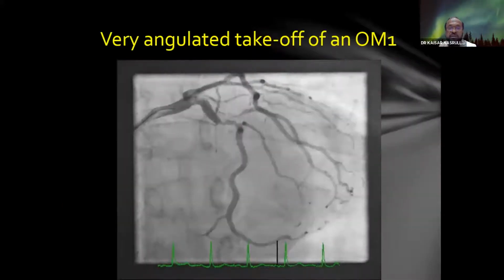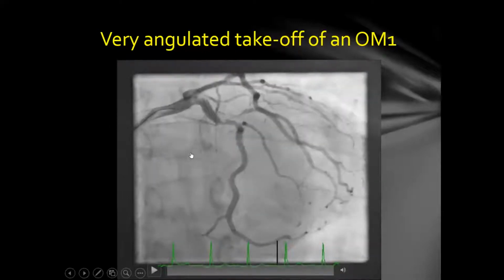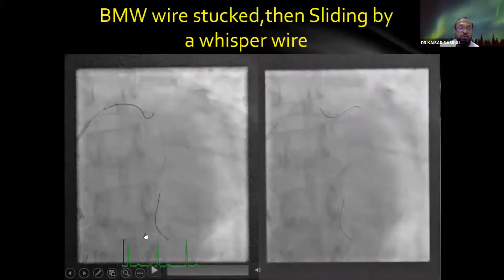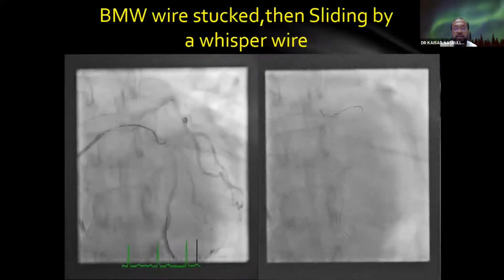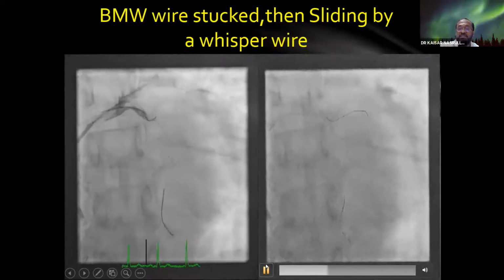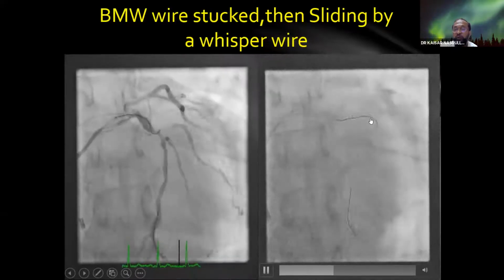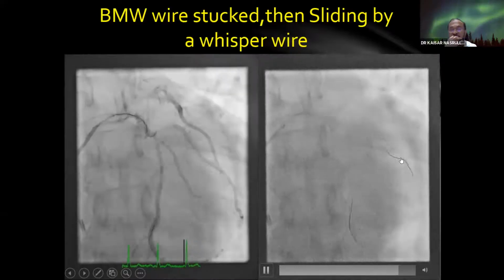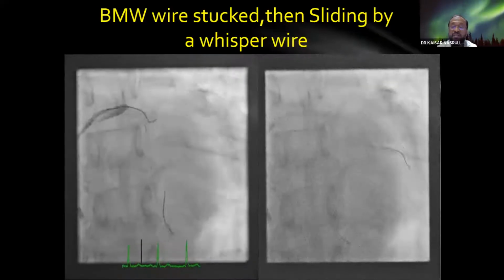And here is a very angulated lesion, angular takeoff of an OM1. You can see this is OM1. This is the OM1 lesion, very tight lesion and angulated. And when we use the BMW wire, it is stuck there. We can't pass through the lesion. Then when you use the Whisper wire, you can see it slides there. See? It's sliding and then moving forwards. So in this type of angulated lesion where the lesion has a small channel, you can use slippery wires, Fielder XTR or Whisper wires.